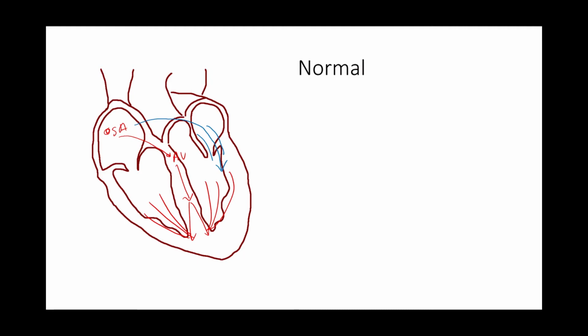Well, because the accessory pathway doesn't have the sympathetic and parasympathetic regulation that the AV node does, depolarization of the ventricles through this accessory pathway can happen before depolarization of the ventricles through the AV node does. Let's think about what our EKG would look like in this scenario.